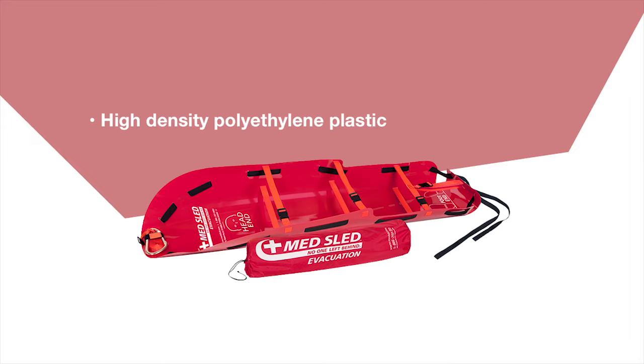Our MedSleds are made of high-density polyethylene plastic. The key qualities of this plastic include flexibility, allowing the sled to be rolled up for storage while still providing its rigidity when deployed. High-density polyethylene plastic also makes the sled very slick, allowing it to easily drag over all surfaces. All of our sleds are decon-capable.